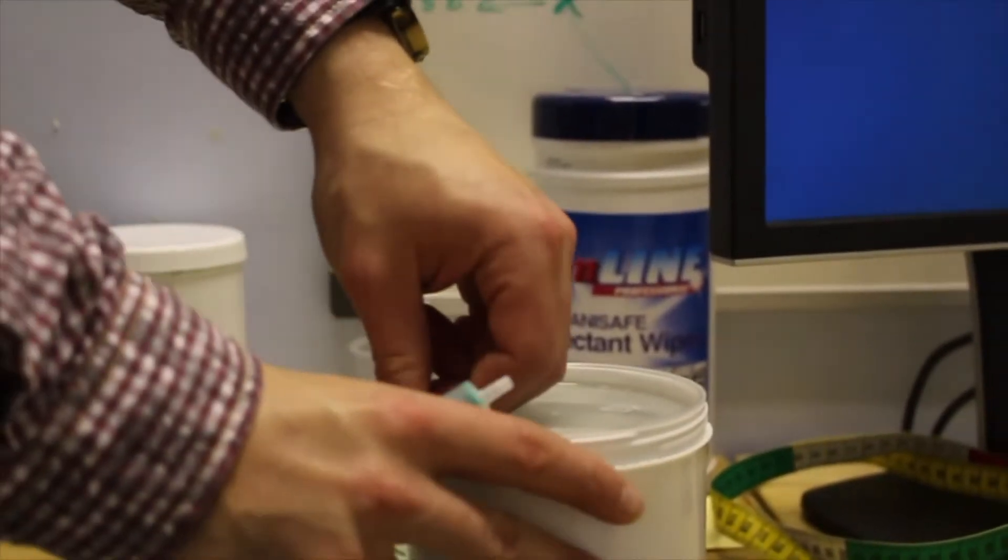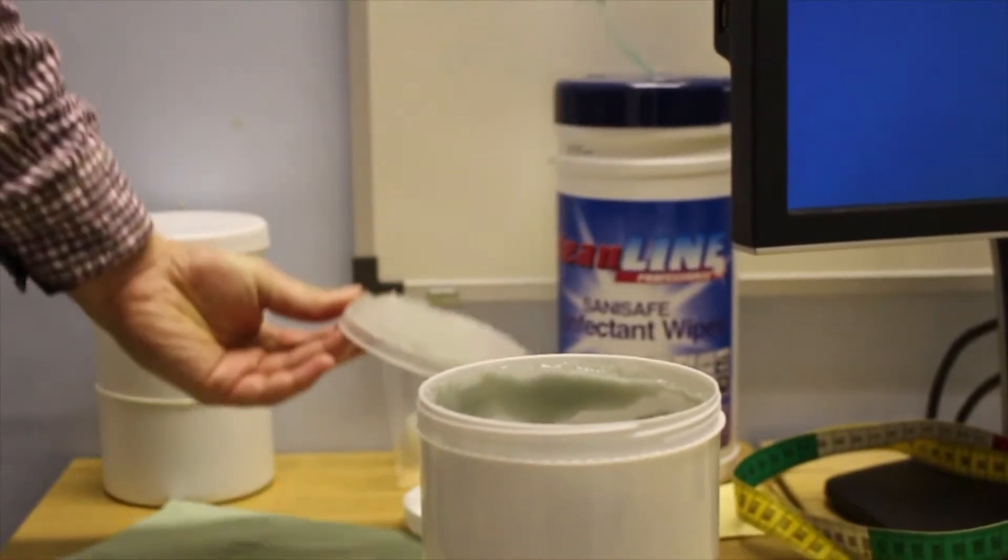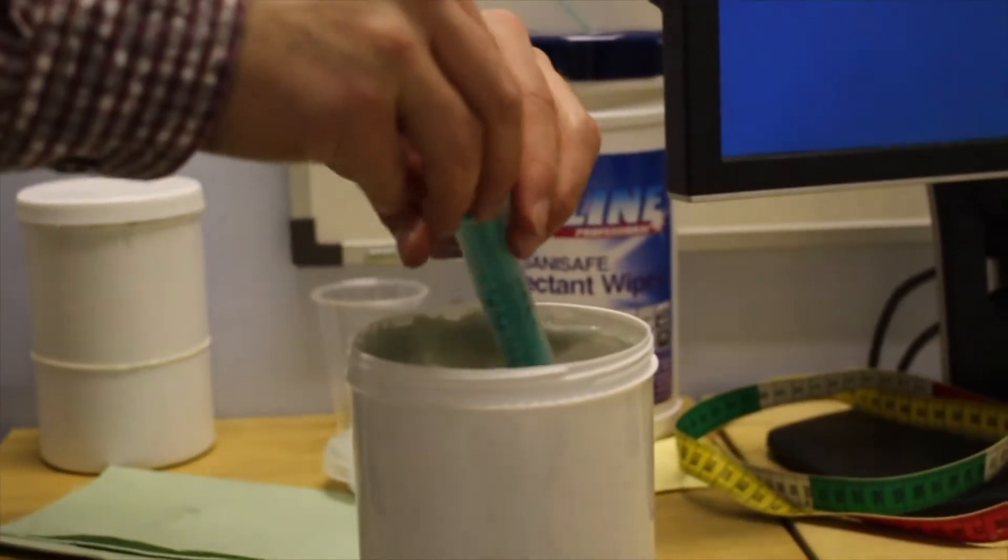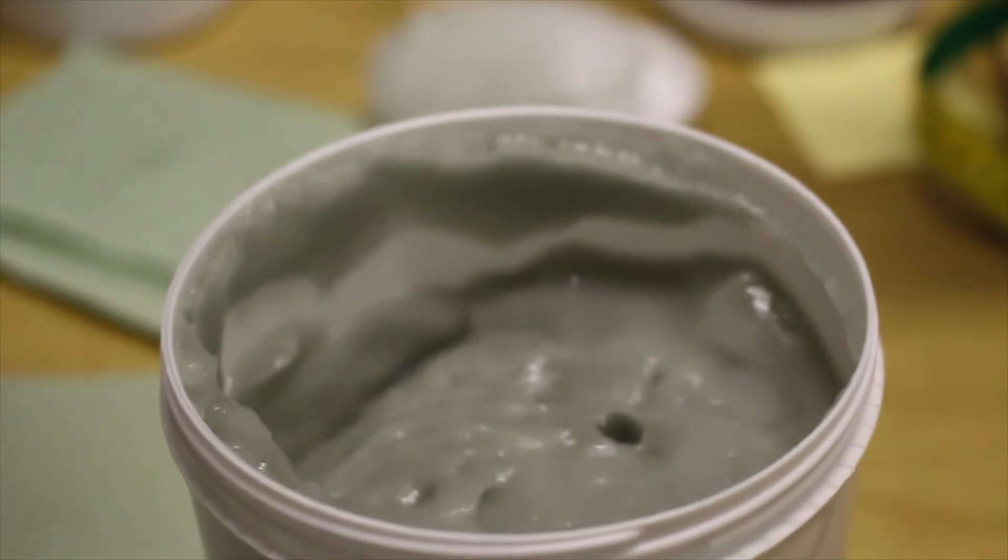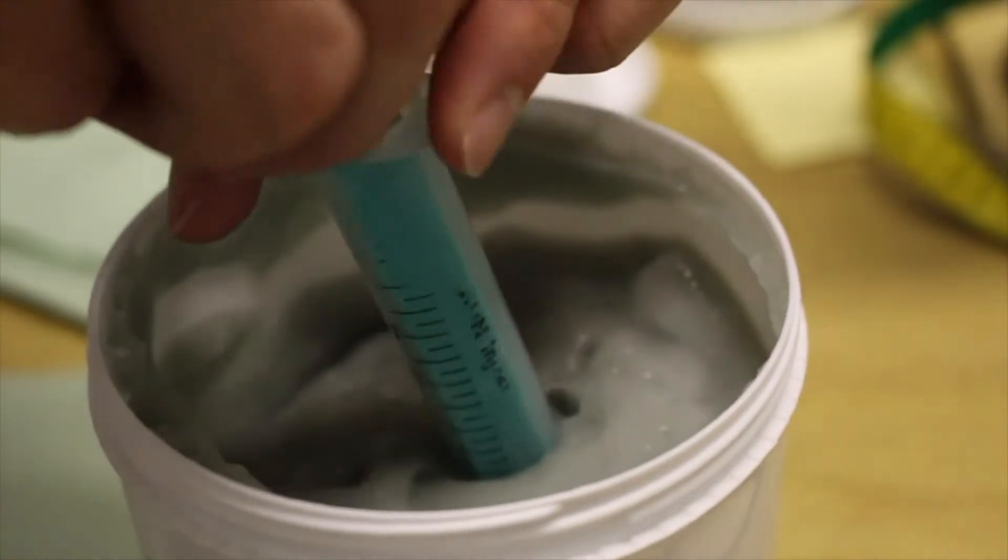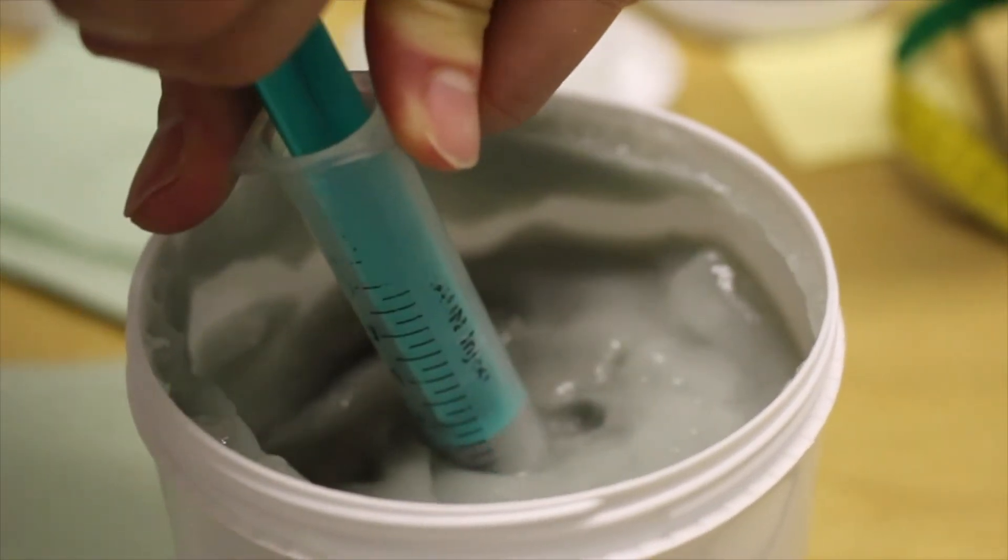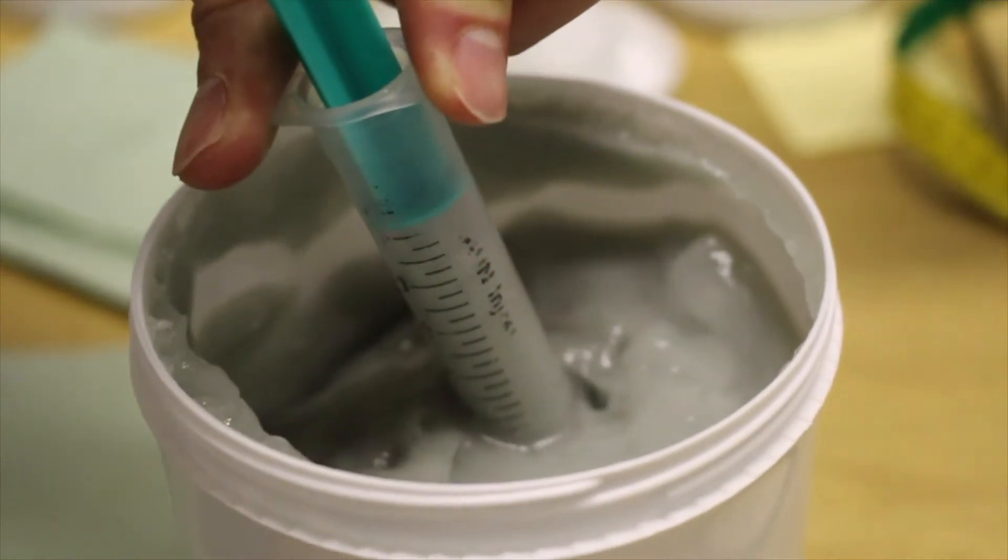Now you can begin filling the electrodes on the cap with gel. Take a clean syringe and fill with the gel. Try to avoid creating any air bubbles in the syringe. You might want to fill two or three syringes to avoid having to go back and refill.